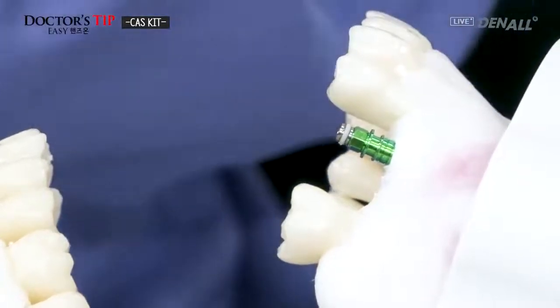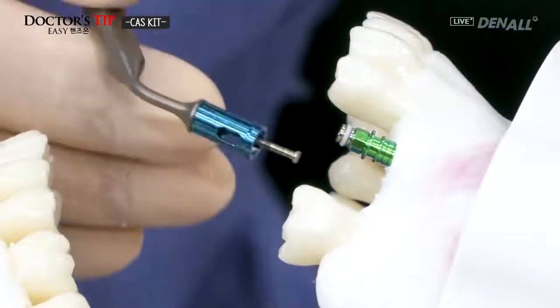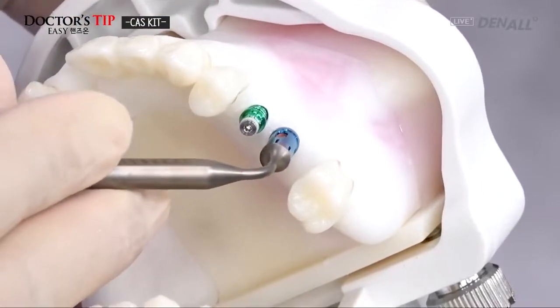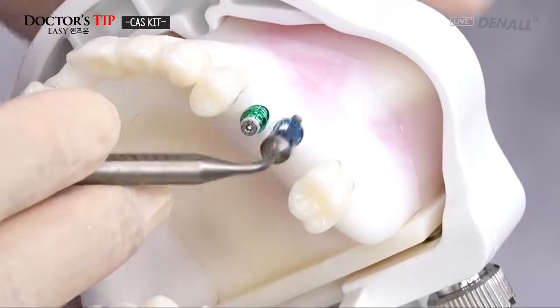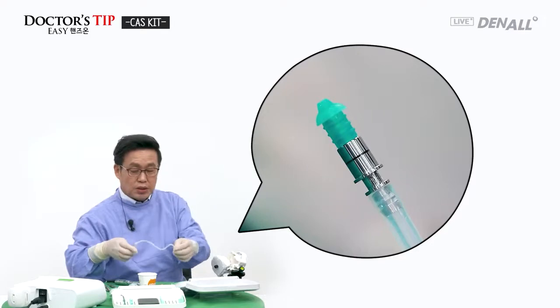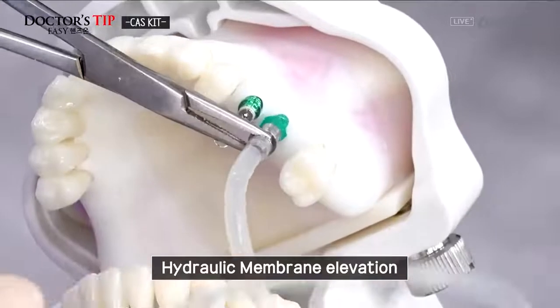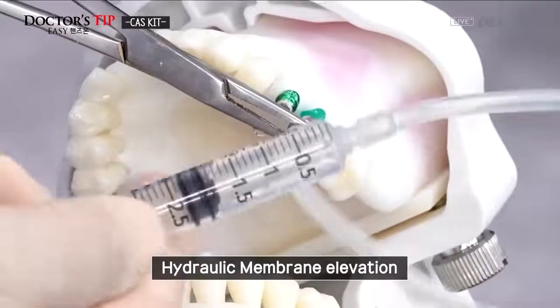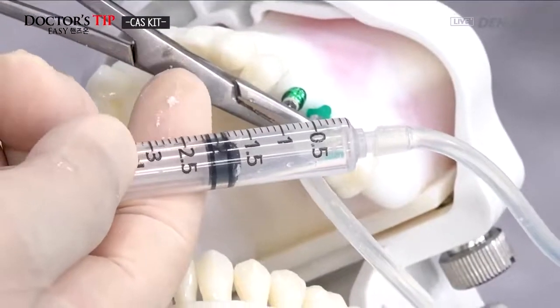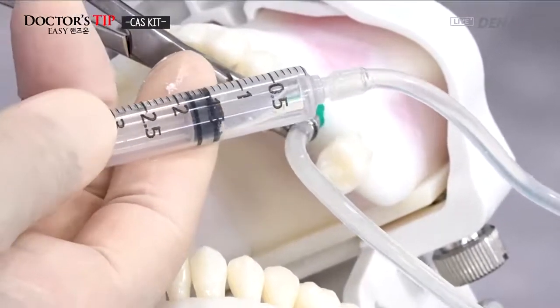Now I can feel it is penetrated. Now it is connected to the depth gauge. The sinus floor, part of it is penetrated. So the hydraulic lifter is to be used again, and it is adapted to the hole. Two milliliters of saline is in the syringe. Infused and aspirated. Infused and aspirated.